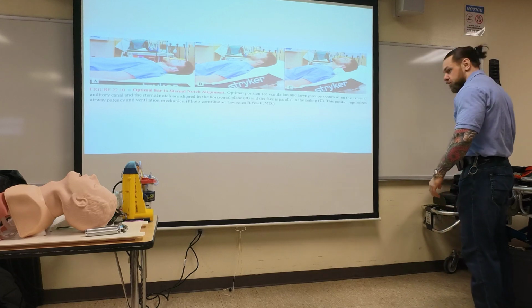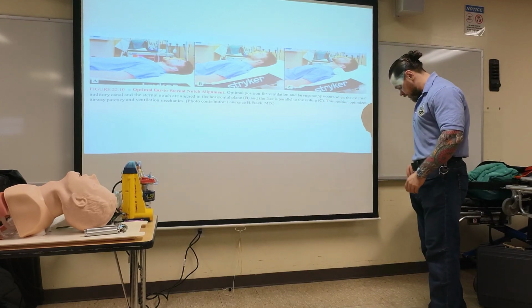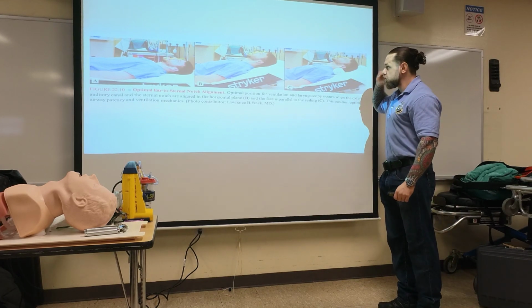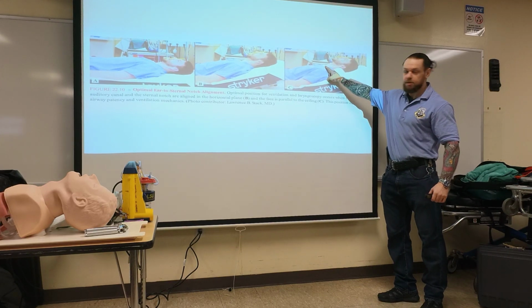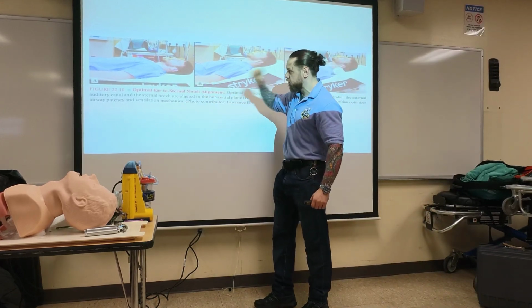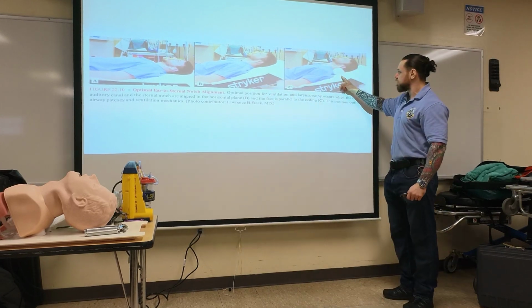So I'm going to show you some of the pictures here, right? How they use it in the hospital. So they put a stretcher and they put a roll right here. The goal is to align the ear hole to the sternal notch and the face is parallel to the ceiling. You see how the ear hole is to the sternal notch, right? Here, it's not aligned, you're not going to have good visual view. Here, you're not going to have the best visual view. And the moment they're in this position, right, they have good view.